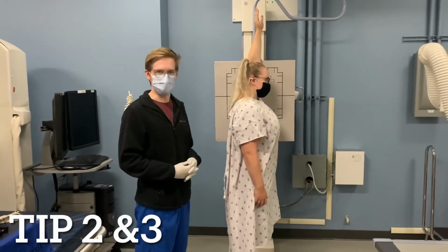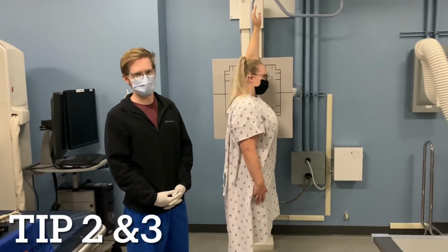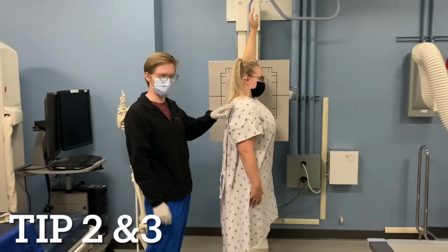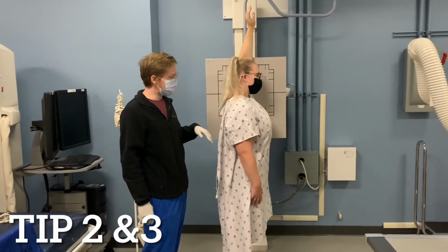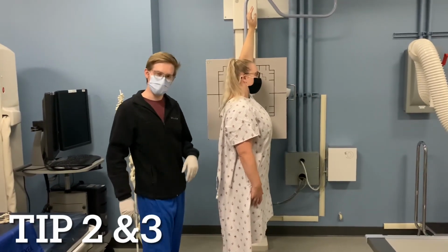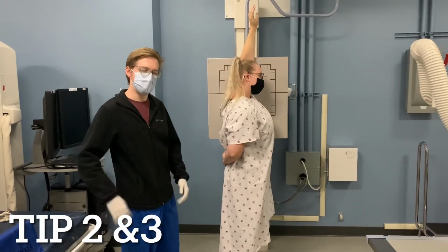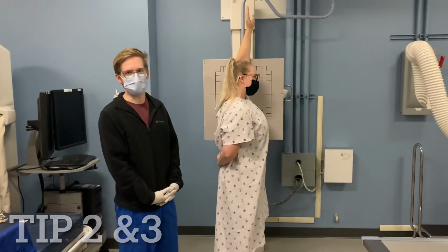A couple helpful tips that we've gathered from some licensed technologists around the area are make your exposure at the end of expiration to keep the humeral head out of the field of view, and then also have the arm furthest from the IR put behind the back to help get it a little down. This will really make a splash with the radiologist with how clean your images look.